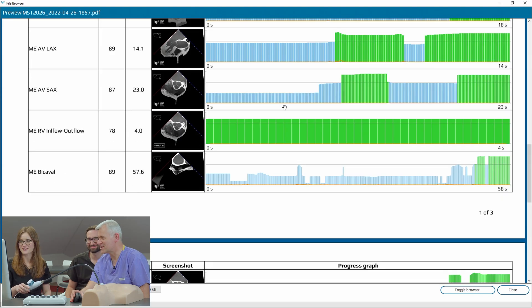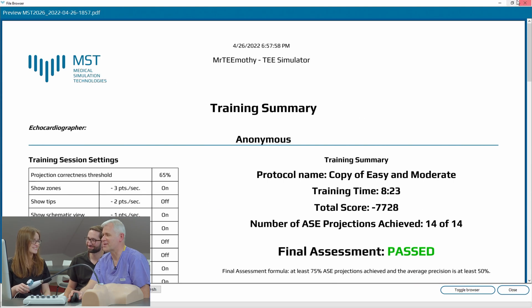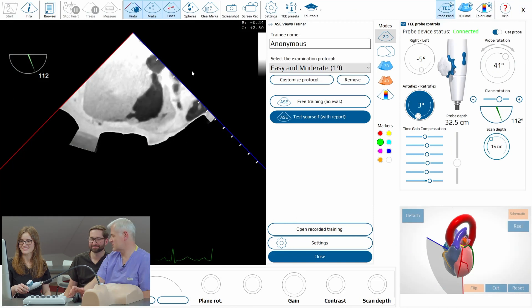For the first time it's not that bad. Is that really the first time? Are you sure? Yes, yes. Thank you very much. So you see transesophageal echo is easy. Of course in practice it's much more complicated. But if you practice a lot before you start your first examination, you have much less stress. You are much more precise, going to the right direction, going to the right view. And you will do it step by step easily.